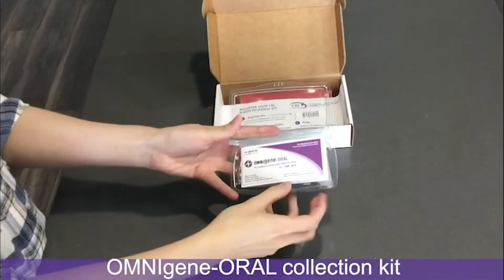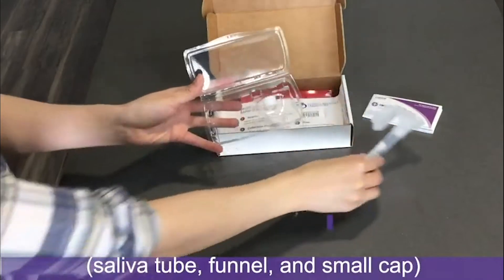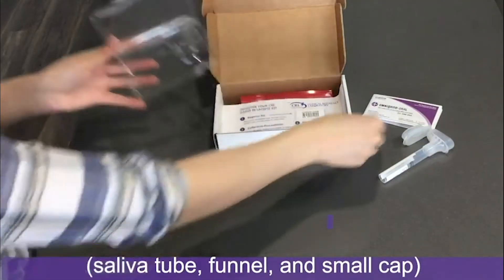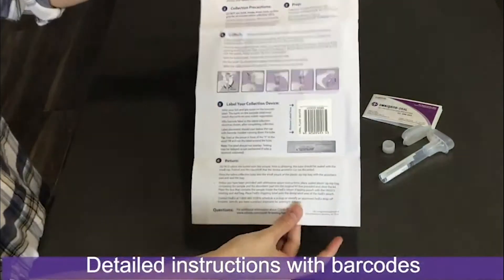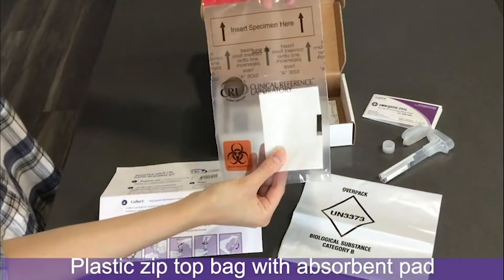The kit contains the OMNIgene-ORAL Collection Kit, Saliva Tube, Funnel and Small Cap, Detailed Instructions with Barcodes, and a Plastic Zip Top Bag with Absorbent Pad.